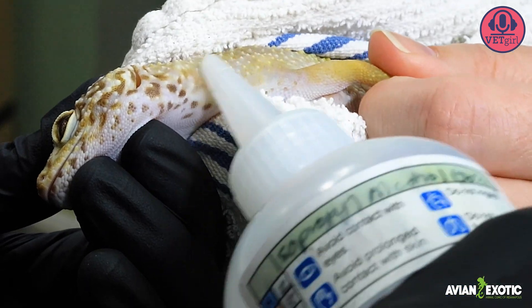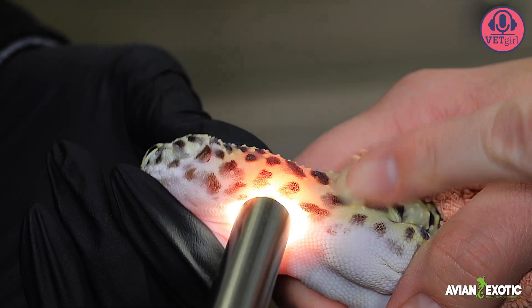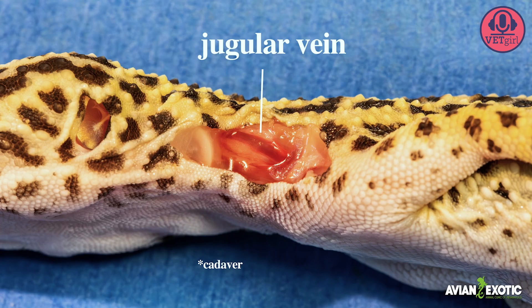Apply a small amount of alcohol to the site. The jugular vein may not always be visible, and a light source may help with visualization. Otherwise, use the landmarks between the ear and the proximal forelimb.